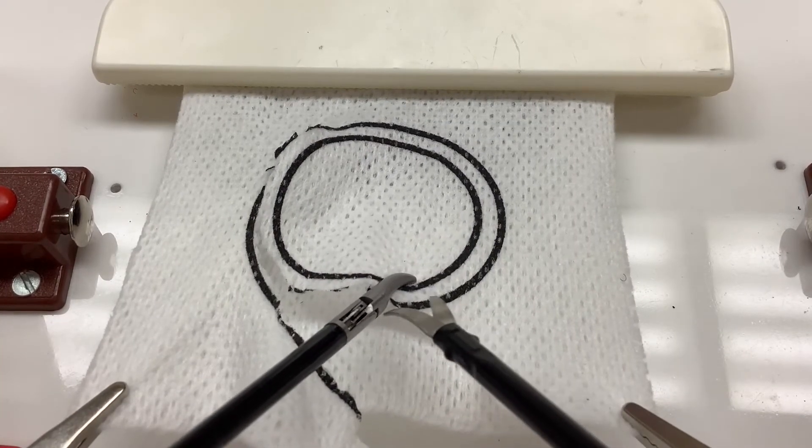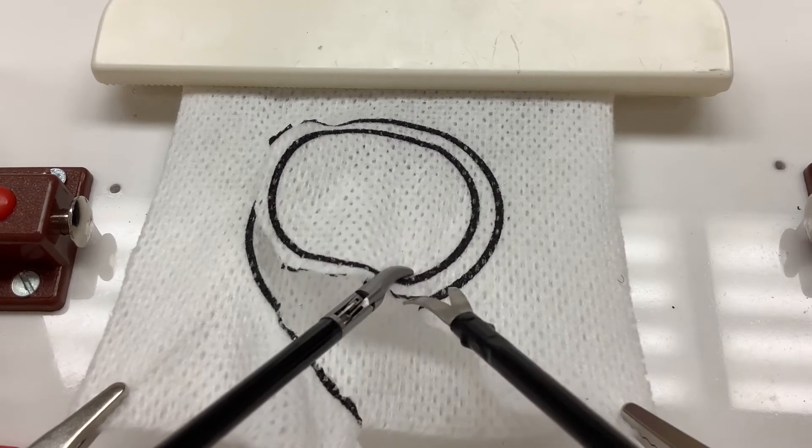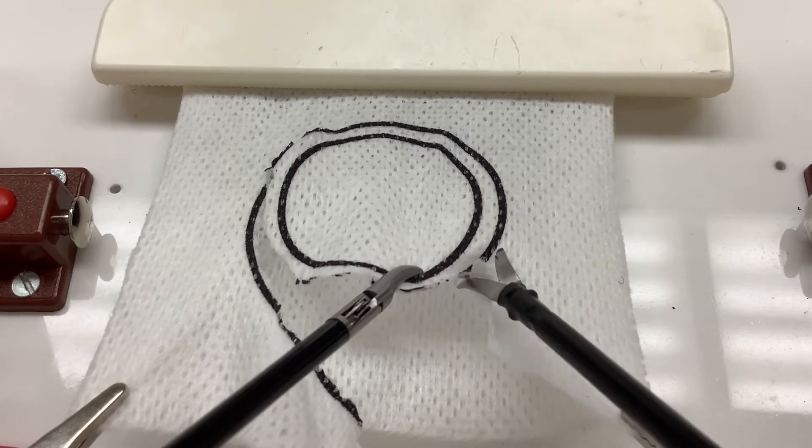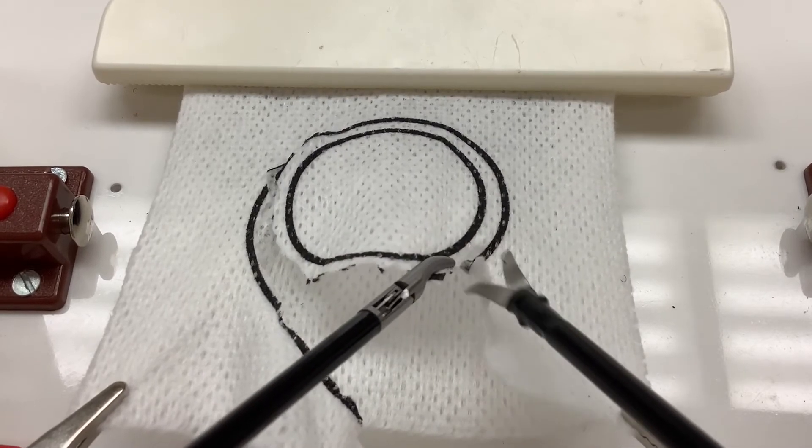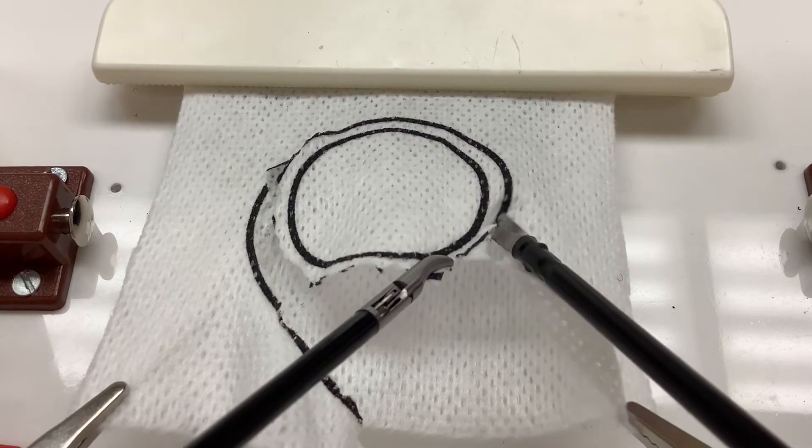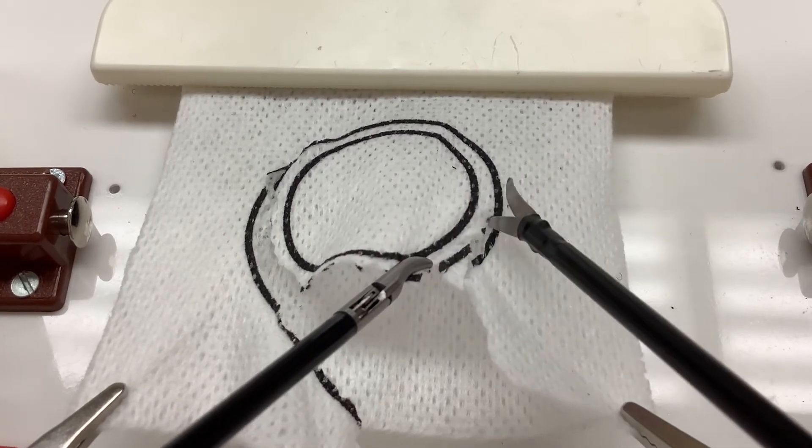After cutting from 5 o'clock to 11 o'clock in a clockwise direction, return to the 5 o'clock position and complete the dissection in the opposite direction. We recommend this technique because there is no need to transfer the scissors to the opposite hand during the task.